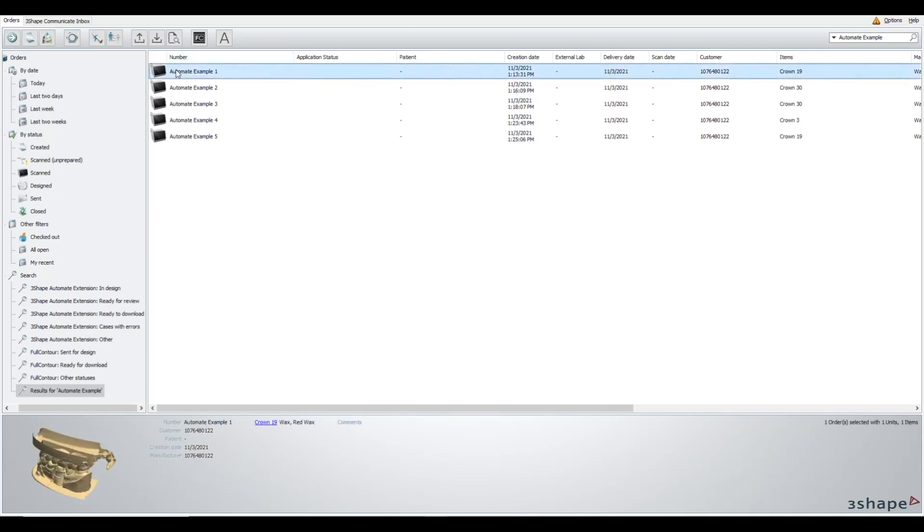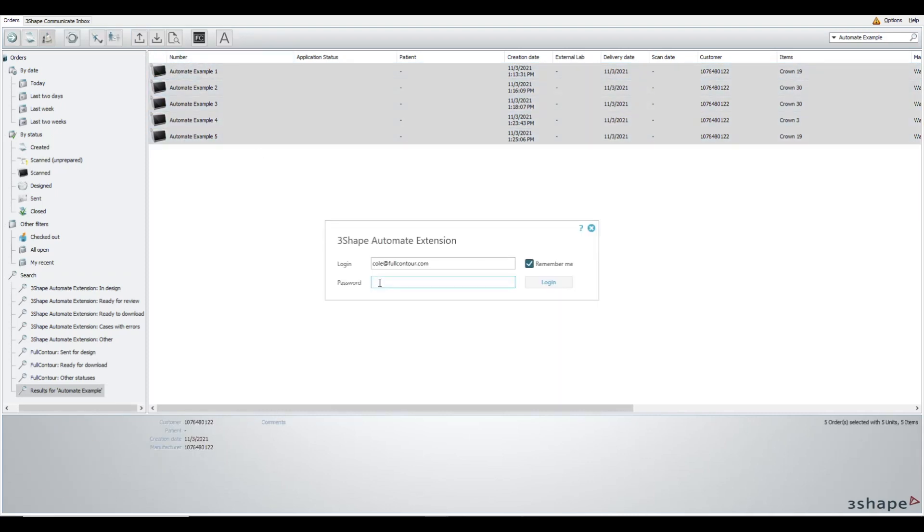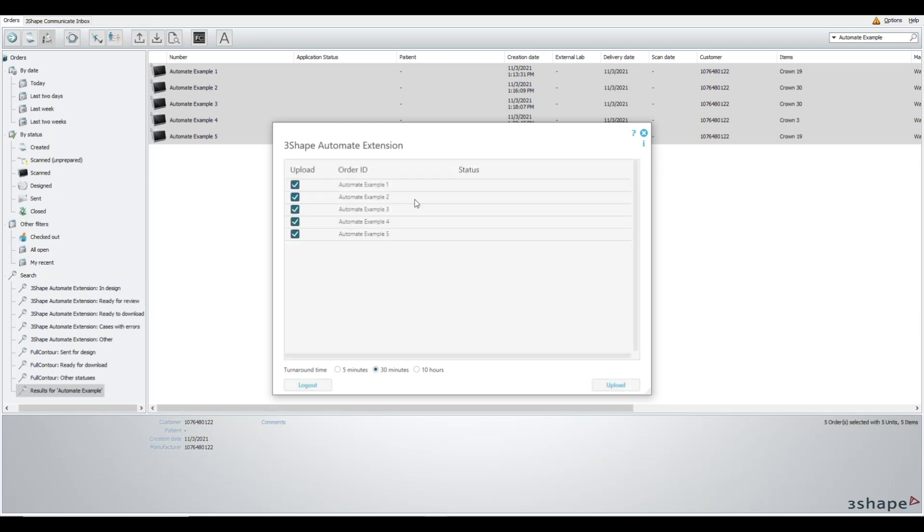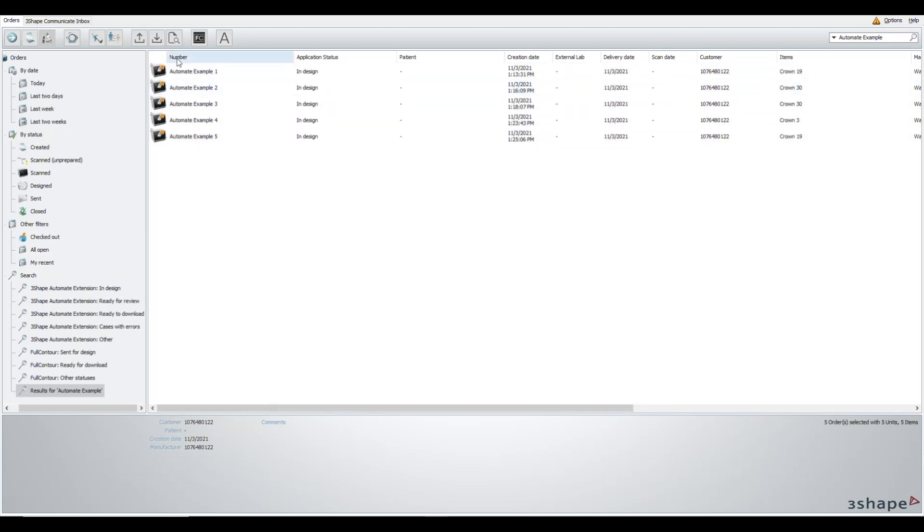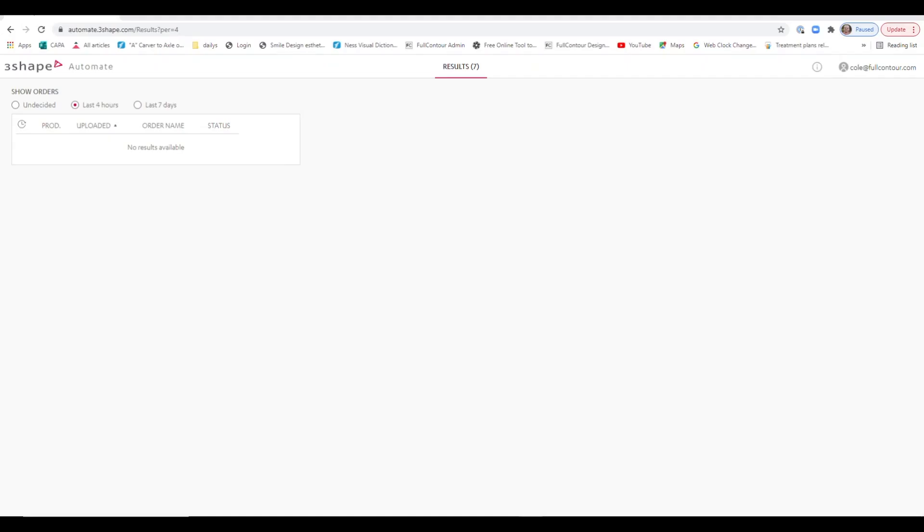Bulk sending with Dental System 2021 to 3Shape Automate is super easy. Highlight your cases, click the upload button, enter username and password, and then you'll see your orders update in your extension view. Select turnaround time, click upload.